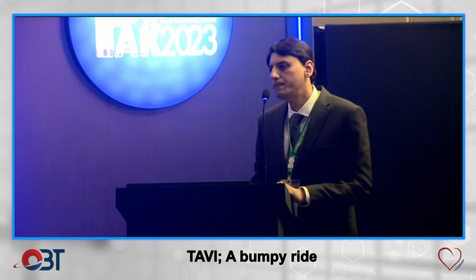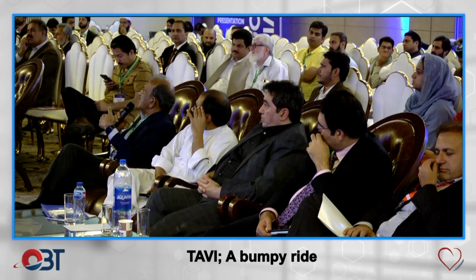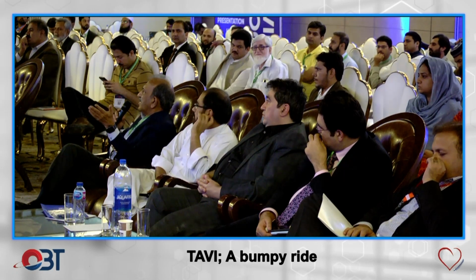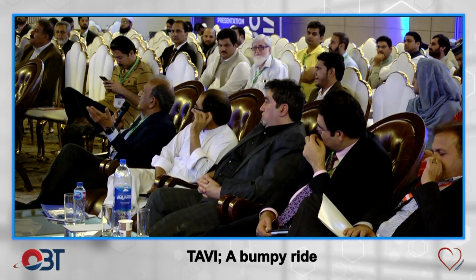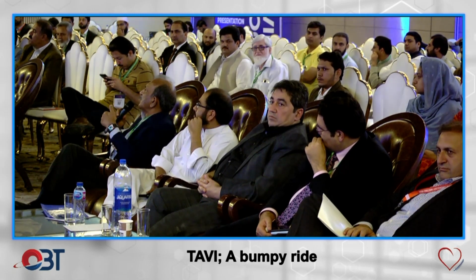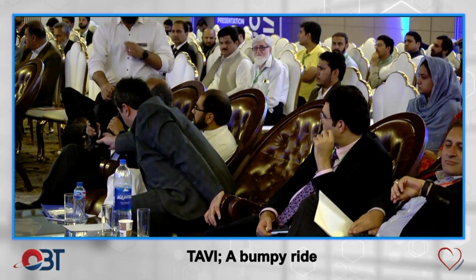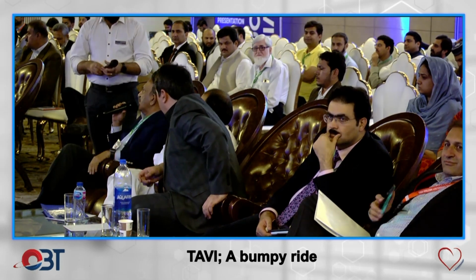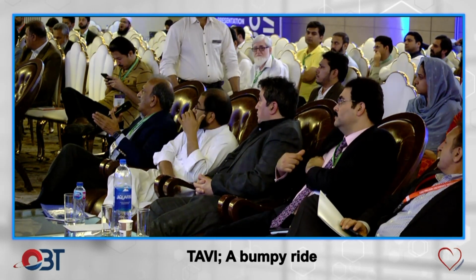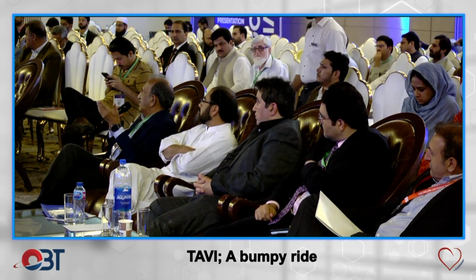What Dr. Shahbaz Qureshi was saying, that annulus measurement should be a routine on echo. And then when you are doing the CT, you obviously do that again, so we do not miss anything. And similarly, CT calcium score is a routine thing. Another thing about the coarctation, the gradient was less because of the tortuosity of the vessel. It was more of a tortuous aorta. I don't think I have seen anybody crossing more than a 40-50 gradient with the valve.